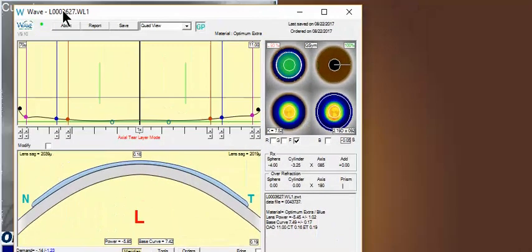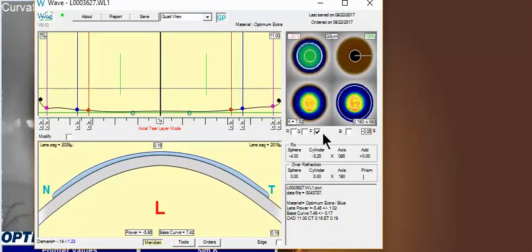And then I might even recommend simplifying the design, and instead of using Freeform, go with the G-sym. And that's going to be more of a back surface or bi-toric lens. I think using those two little tips, that'll get you back on track with this.